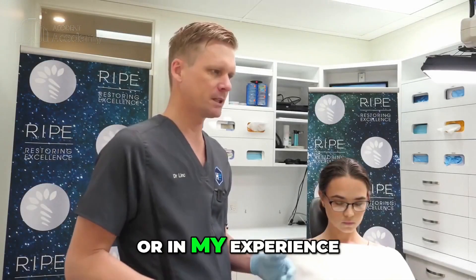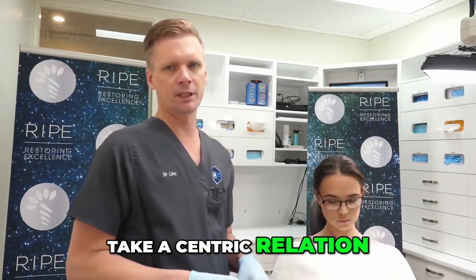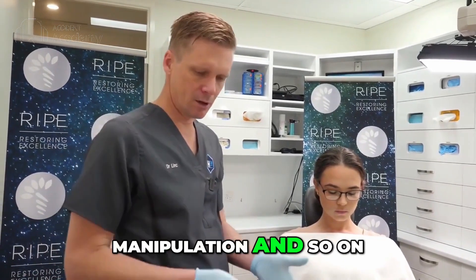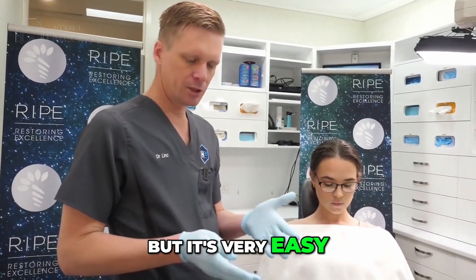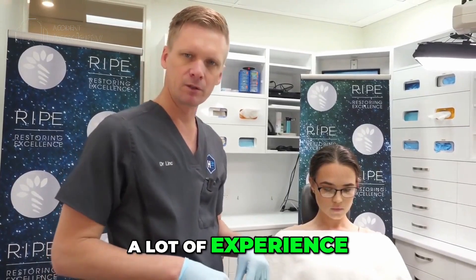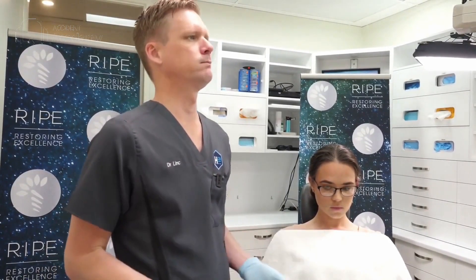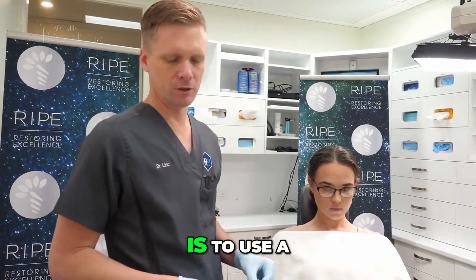In my experience, the easiest way to take a centric relation bite — you can use bimanual manipulation and so on, but it's very easy as soon as the teeth touch for the patient to bite, and it takes quite a lot of experience to do that. So the most easy, simple way I've found is to use a leaf gauge.